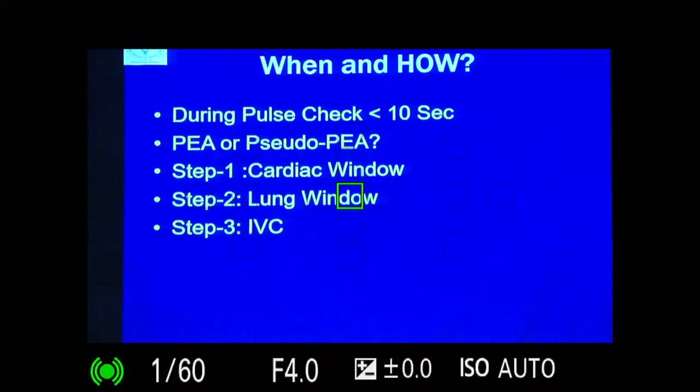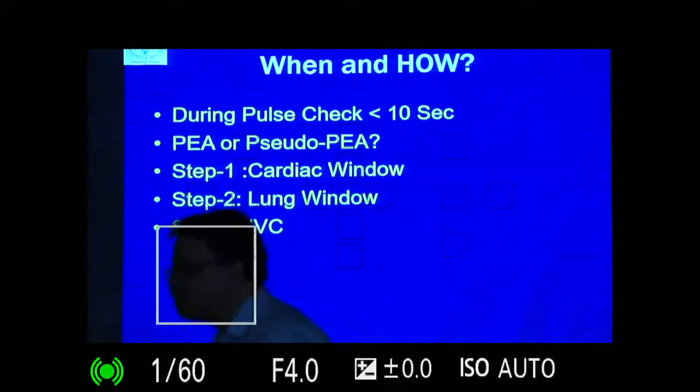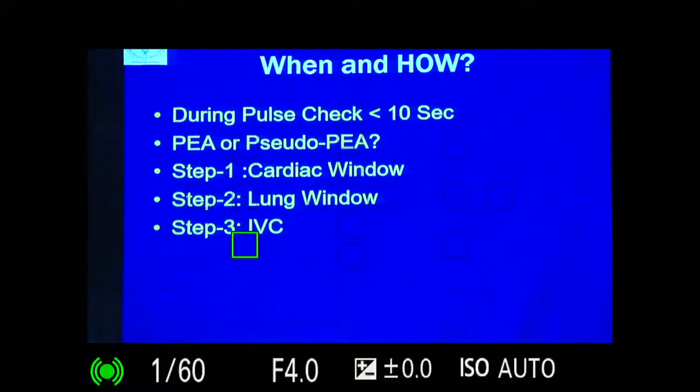So, these are the 5-6 questions you need to ask very clearly, or the heart is beating very fast. Is it hypovolemic? Okay. The LV is kissing. You understood? Either it is kissing or it is not contracting. Okay. LV. I am only interested in the LV first. Or is there a regional wall motion abnormality, or both the chambers are looking alike, or there is a fluid with the heart unable to expand properly, sitting cowered like this, because there is fluid all around. You understood? So, first thing, if you get an answer in step 1, you do the job.